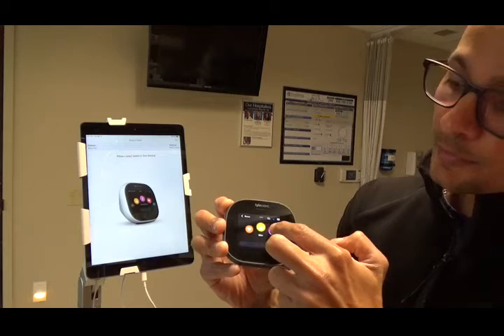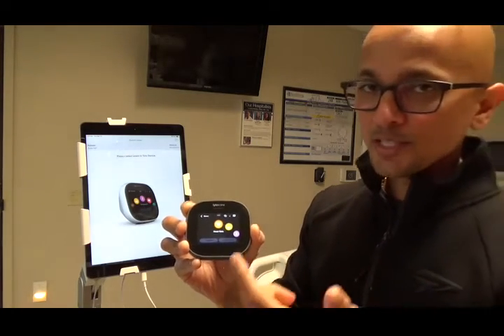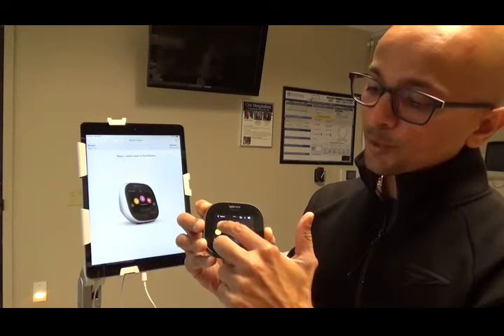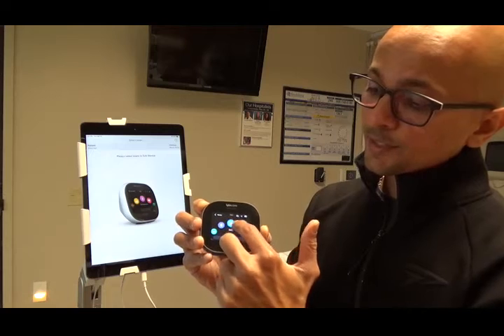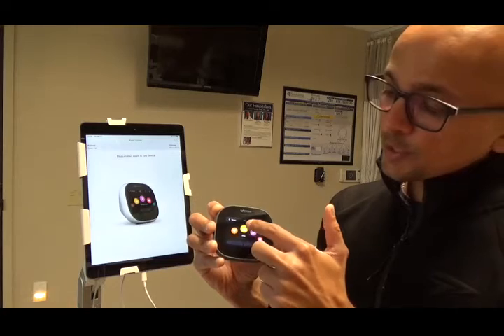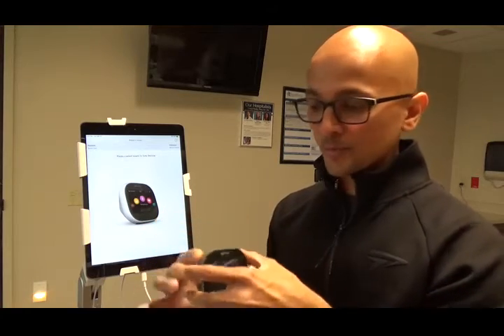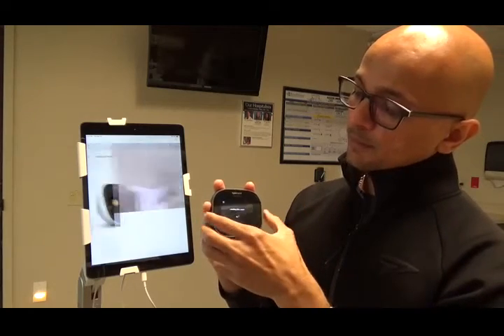So on the left-hand side right now, at least, you have the heart rate. Usually in the hospital setting, you won't use this as much because you already have the pulse from your screen or bedside. You have the skin exam, the temperature, auscultation for the heart, lungs, oropharynx, ears, and general auscultation belly, right? So instead of doing the heart rate, I'll jump onto whatever we could do without any attachments, right? So it has no attachments right now. So we'll go ahead and do the skin.